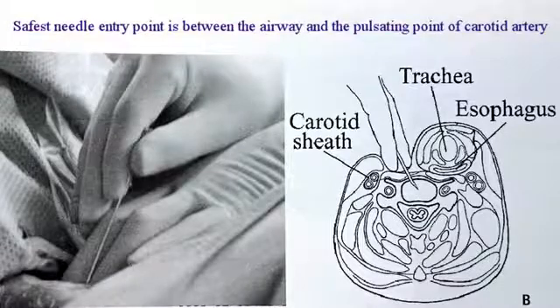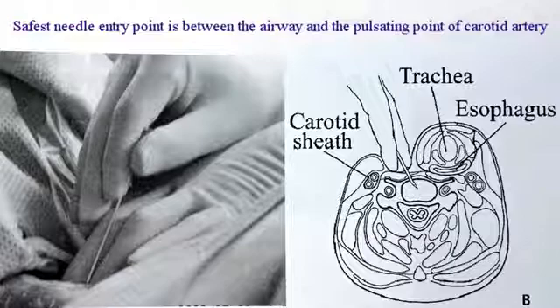We can see here now the middle finger is pushing the trachea medially, and simultaneously all other structures of pretracheal fascia are moving together. And by the index finger, the carotid sheath is pushed laterally. The space in between the fingers is created to enter into the cervical disc anteriorly. We can see the needle trajectory.